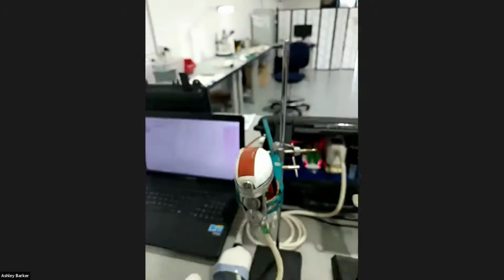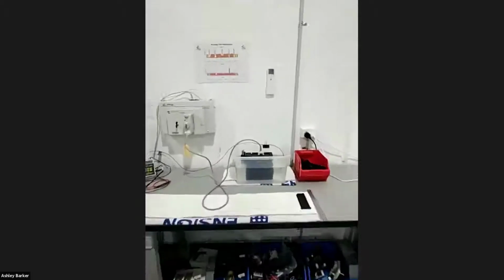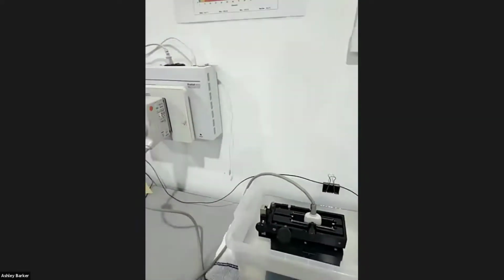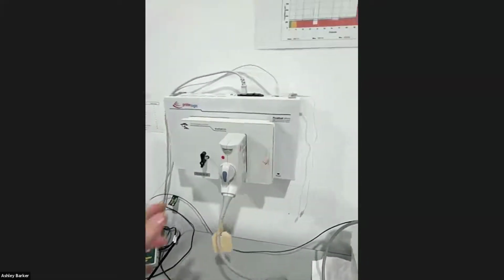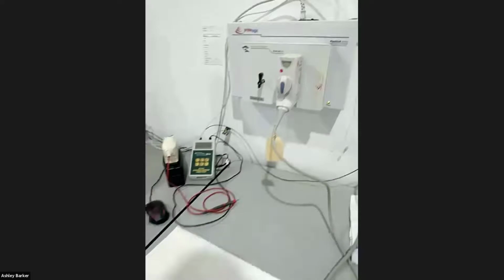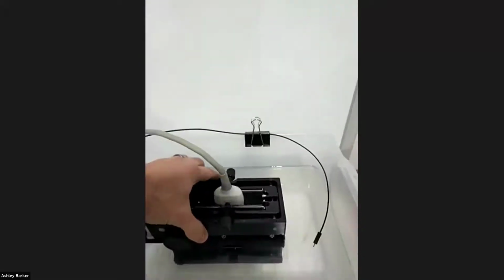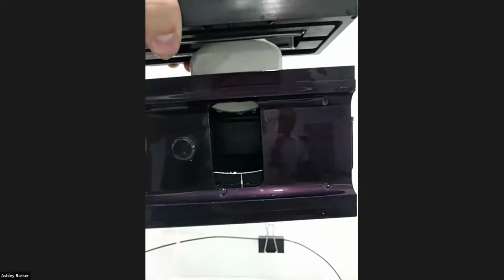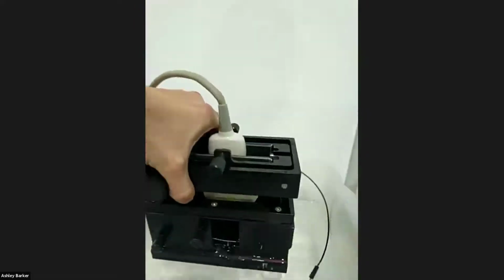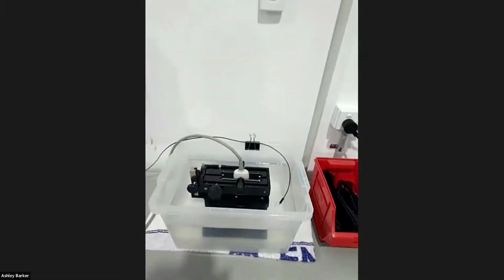Wow. And the last thing I thought I'd show you is I've mentioned many times about acoustic testing, but I haven't gone into depth as to what that is. So this is our acoustic tester here. We're able to plug probes in. Every probe needs an adapter, and we have suites of adapters that we can use to connect the machine. The probe gets put in a water bath in a target. You can see that probe is facing down at a target at the bottom. We then fire each one of the crystals independently, and we look for the reflection.